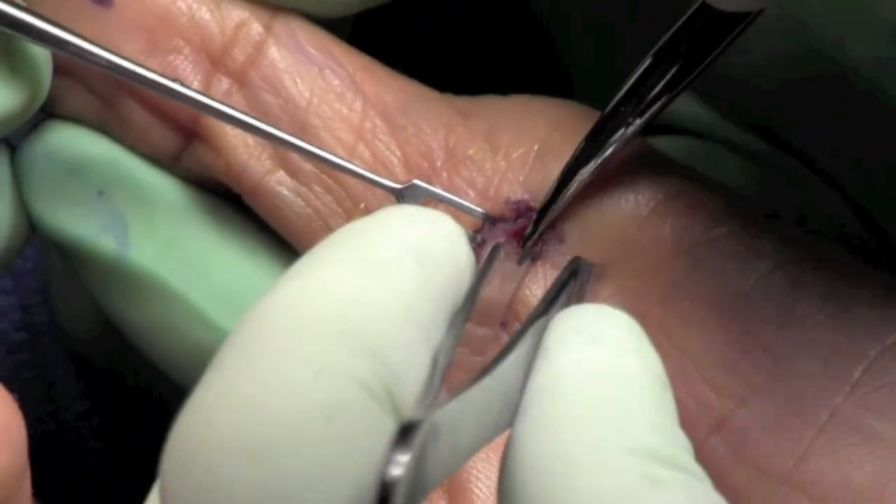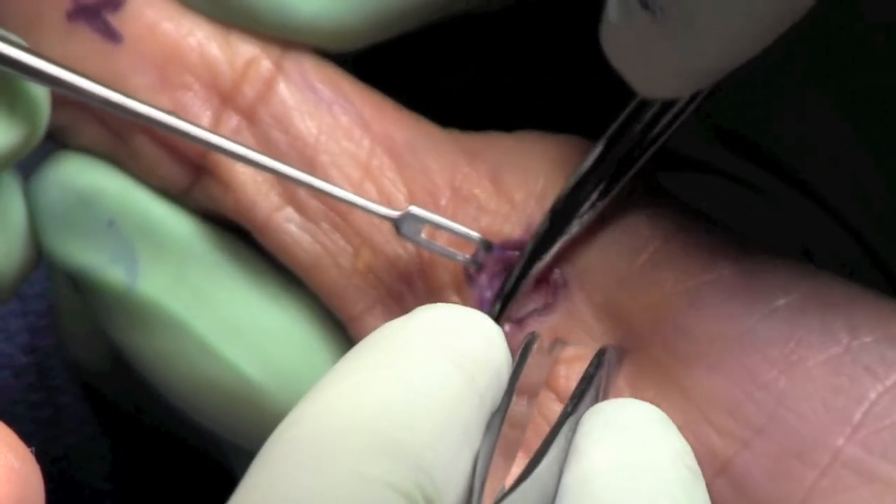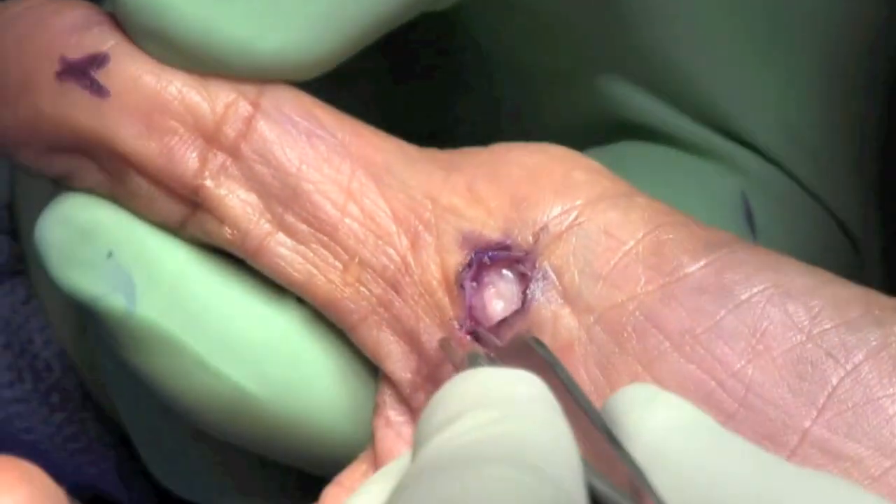Using small double hooks, we're able to dissect with care taken again to remove the tissue and get down to the flexor tendon sheath.